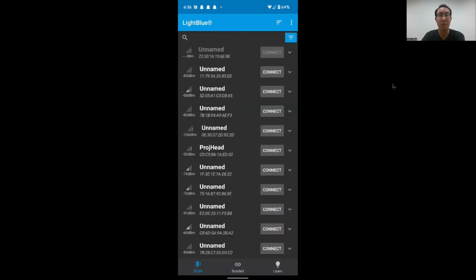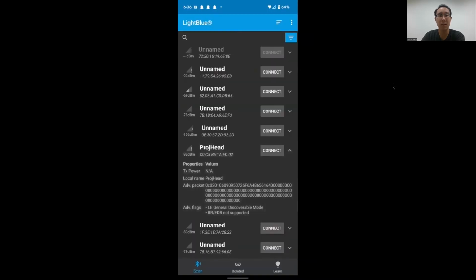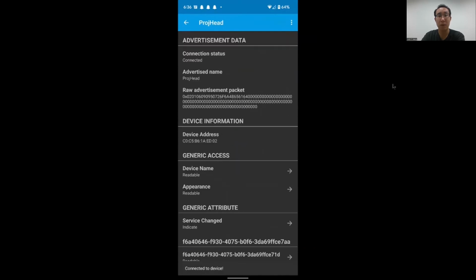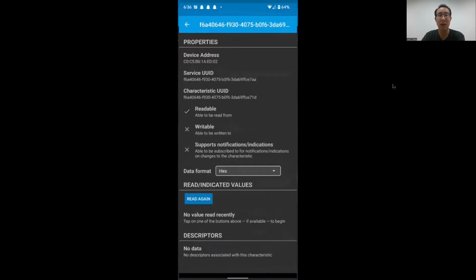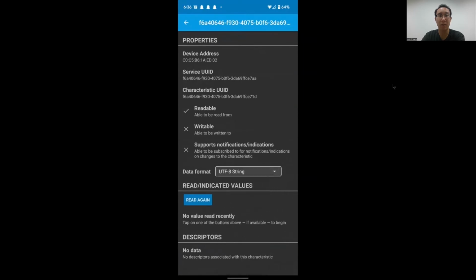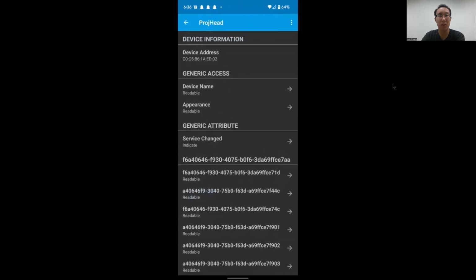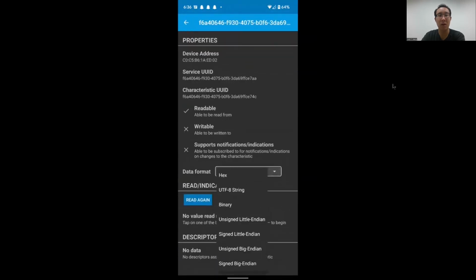And now we're in the app view. First, we connect to the device. And once we've connected, we begin looking at the values in the Bluetooth table. First, starting with the unique ID of the device, which is arbitrary for now. Next, we look at the true-false variable to determine if we have a concussive impact or not. And finally, we looked at the raw acceleration value in G's.